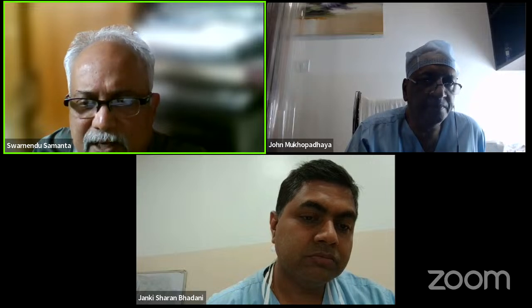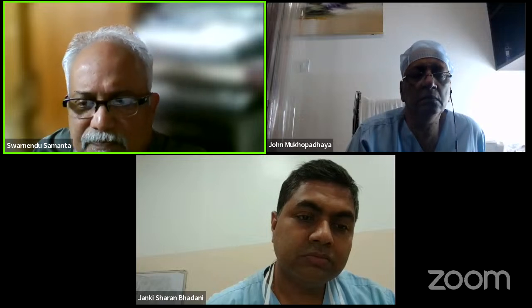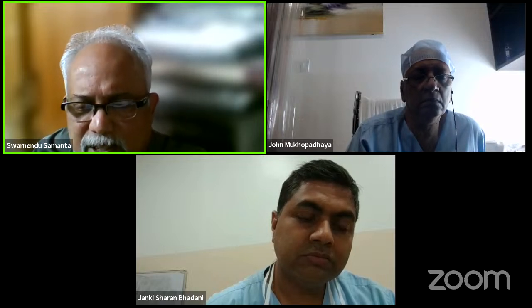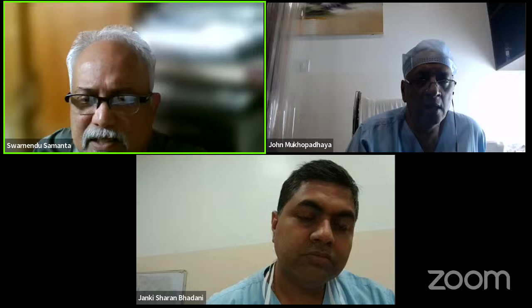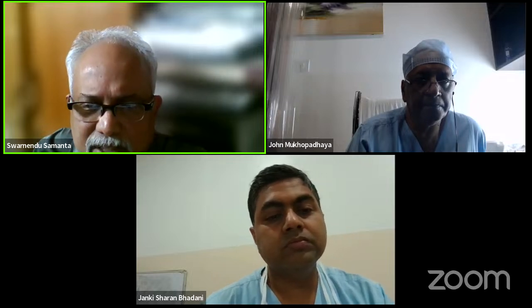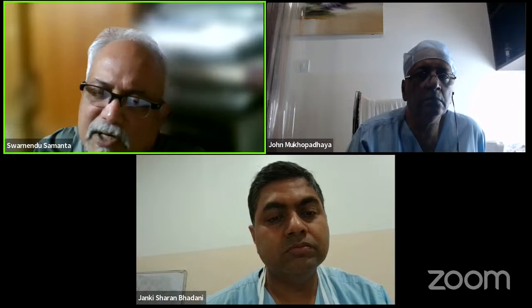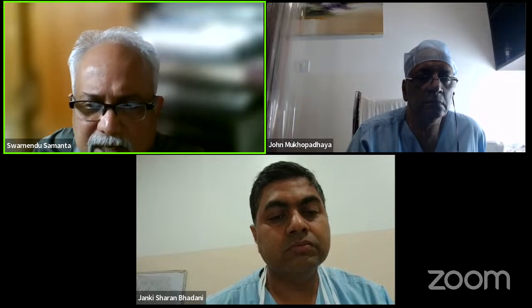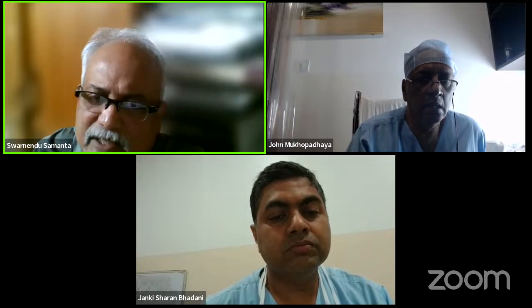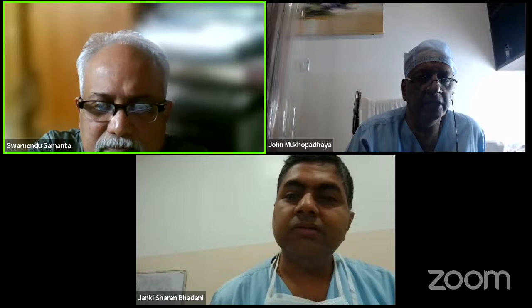The problem is that clinically also you have to find that there is tenderness on the front of your humeral head. And once you see the MRI picture, as I have shown you during the discussion of the MRI, how the classic HAGL will look, it is known as the inverted J sign. Also, in the axial cut, you will find that the ligament has been avulsed from the humeral side. So your clinical test, tenderness on the front of the humeral head, and your MRI will tell you that this is the HAGL lesion. Okay, does that answer your question, Rajan?